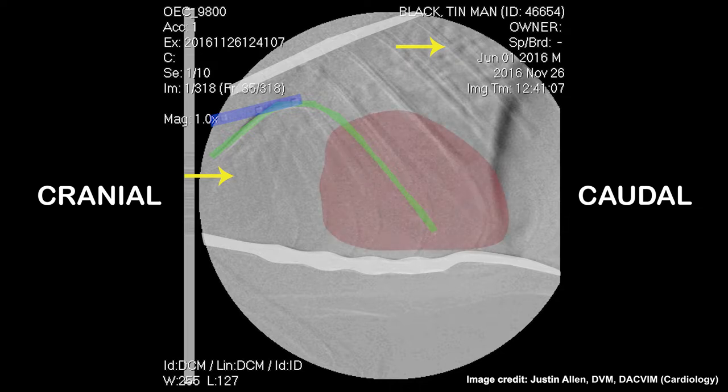The red area shows where the heart is located. The pulmonary trunk is located in this area, shown in purple.